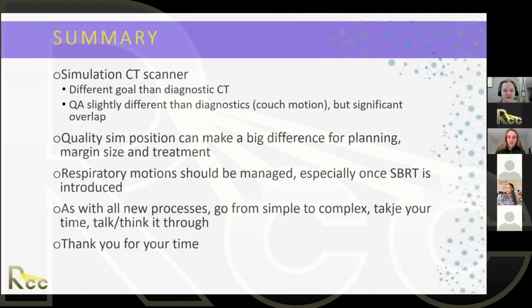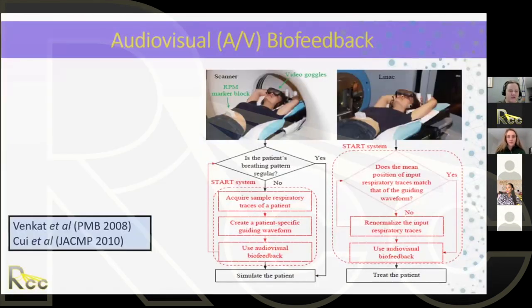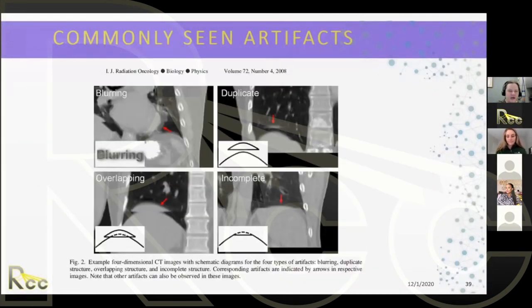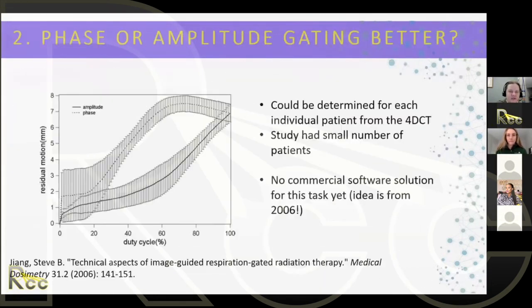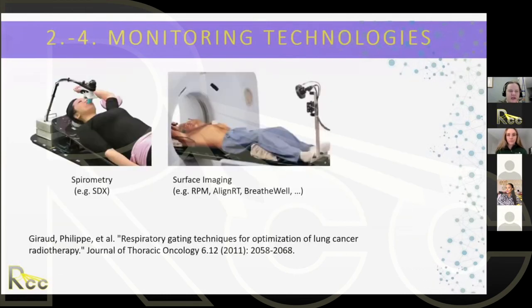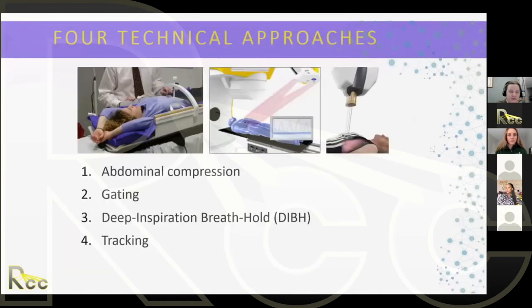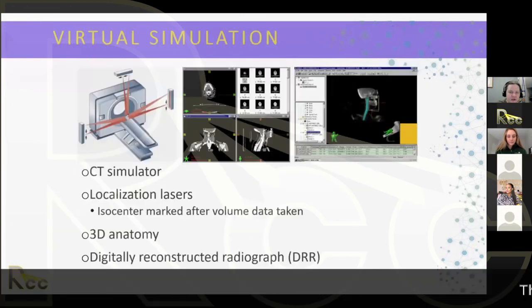I think someone asked a question in the chat now. It says, can you please elaborate a bit on the use of gating and motion management in breast cancer? Oh yeah, I did not cover breast because this was specific on IMRT, but I highly recommend it. So the issue with breast is lung, of course, and heart dose, especially with the long survival rates.